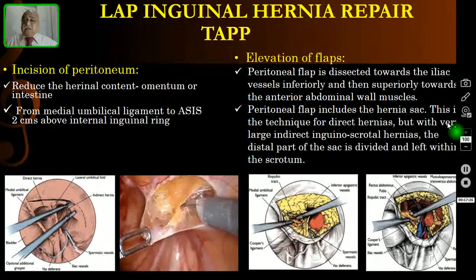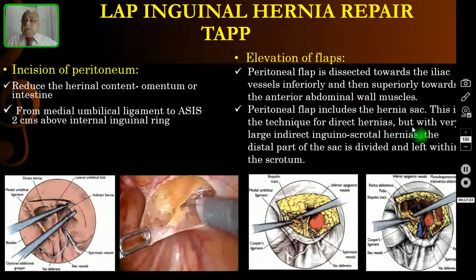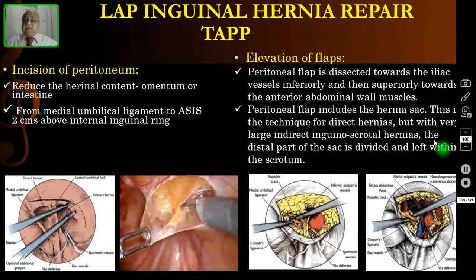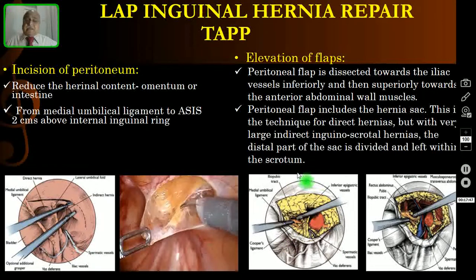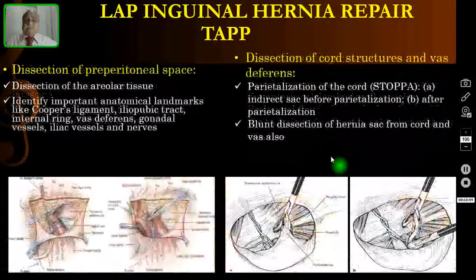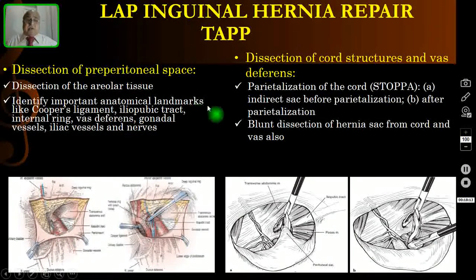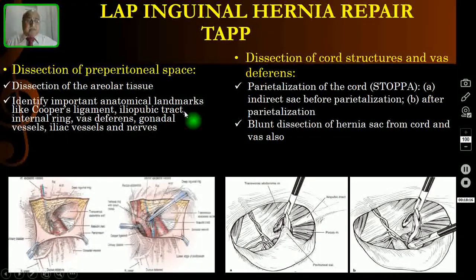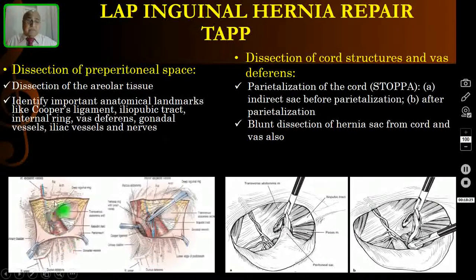For a direct hernia, the sac is easily reducible — if you pull the peritoneum, it will come out. For very large indirect inguinal scrotal hernias, the distal part of the sac is divided and left within the scrotum, and the proximal part is ligated. In the preperitoneal dissection, you must identify important anatomical landmarks: Cooper's ligament, iliopubic tract, internal ring, vas deferens, gonadal vessels, iliac vessels, and the various nerves.